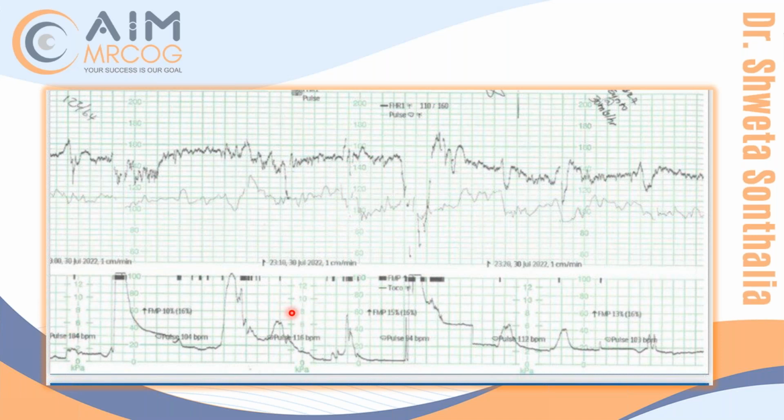So between two uterine pressure peaks, either you calculate, or between two of these 100s, either you calculate. So if you see the contractions, maximum it can go up to 3. Like if I count from here till here, I get 1, 2, 3. If I count from here till here, I get 1, 2, 3, right? So it's 3 contractions in 10 minutes.